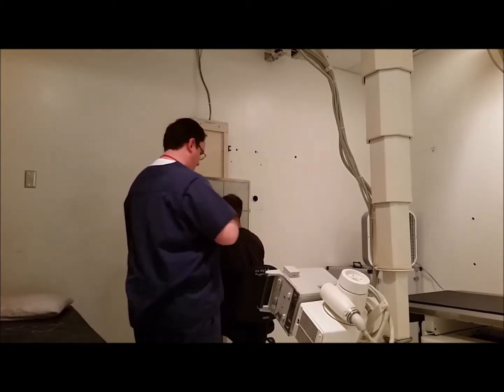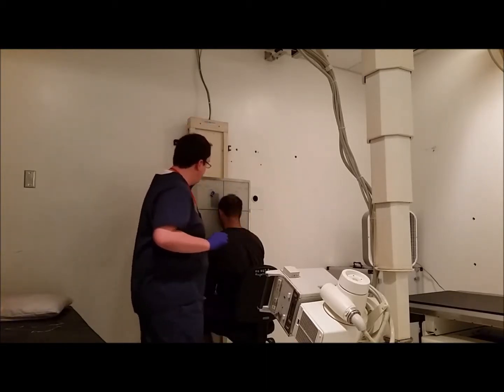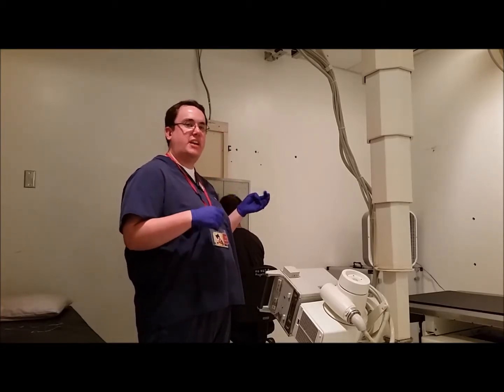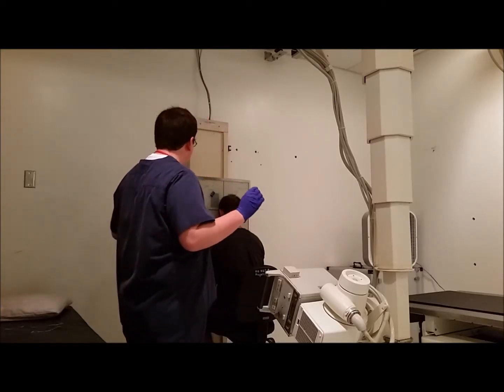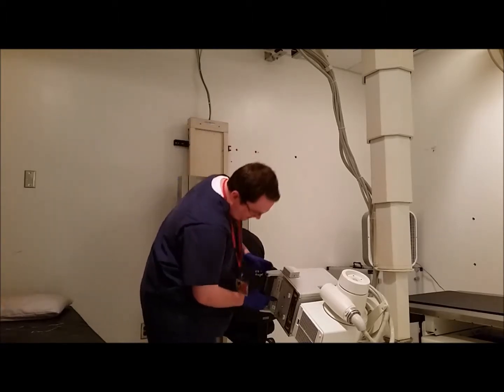There we go. Get our marker on there. All right, so I'll be shooting about 75 at 12 for our view here. Have you hold your breath, sir. Click. All right, breathe.